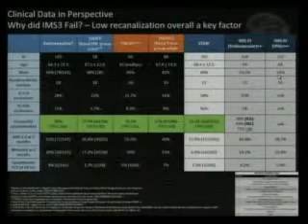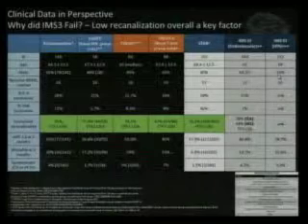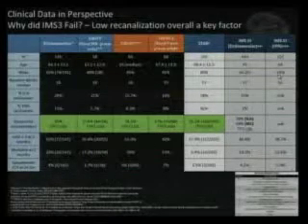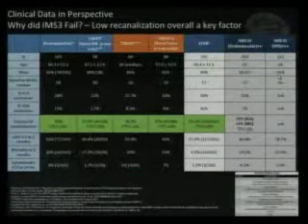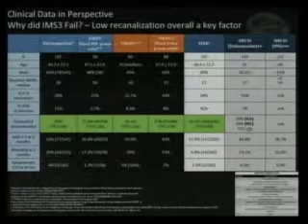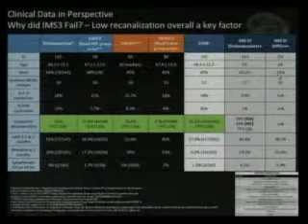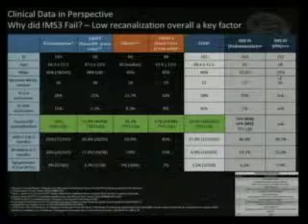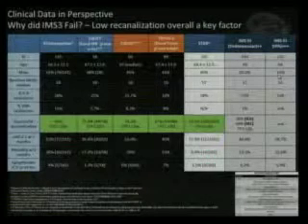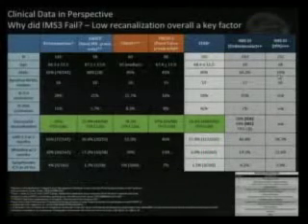They were not the devices that we were using in 2010, 2012, which were the mechanical thrombectomy devices. Their device was the MERCI device, the first mechanical thrombectomy device, which required several passes and didn't work very well. It was like a corkscrew that you put in the clot and then try to take the clot out. A lot of times the clot got disrupted, broke up into pieces and embolized everywhere, and it would require several passes to take it out.